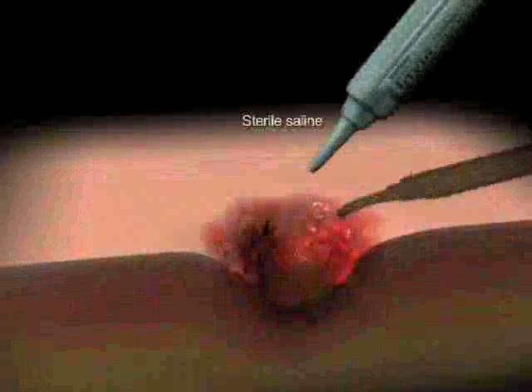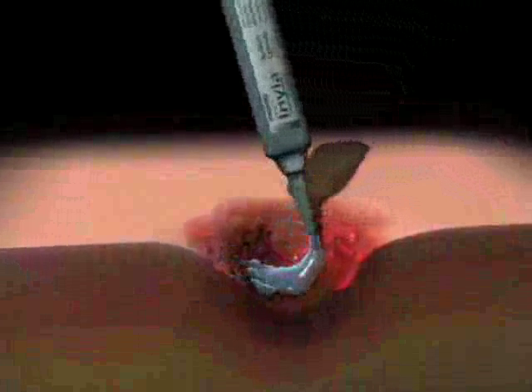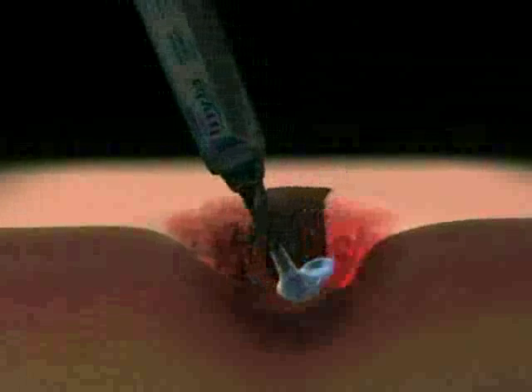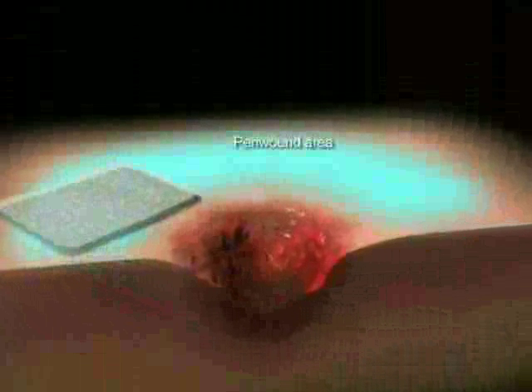Prior to applying Invia Wound Therapy, the wound bed should be thoroughly cleaned according to the physician's instructions or the institution's guidelines. Saline is available in select sets from Medela to aid in the irrigation and cleansing of the wound. After the wound bed has been irrigated, the peri-wound area is dried with gauze to provide an optimal environment for the dressings to adhere.